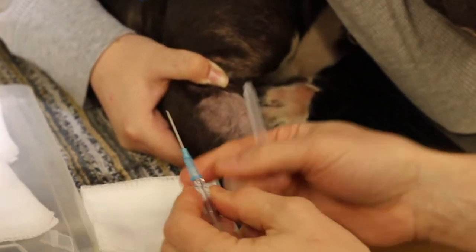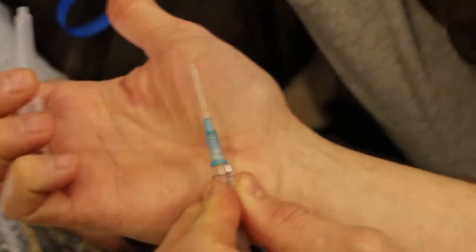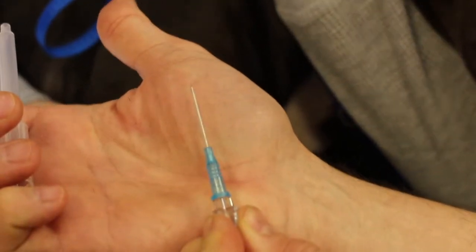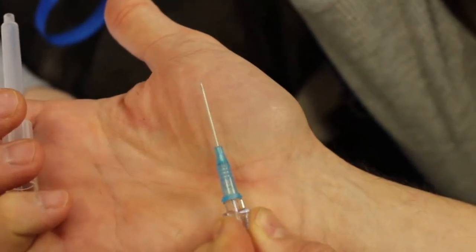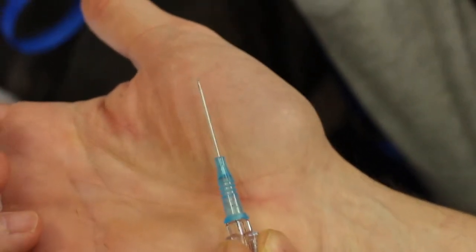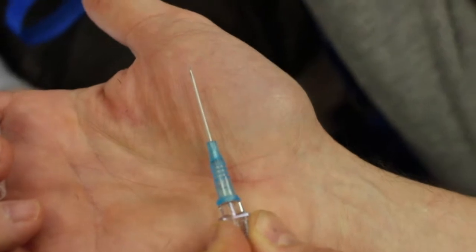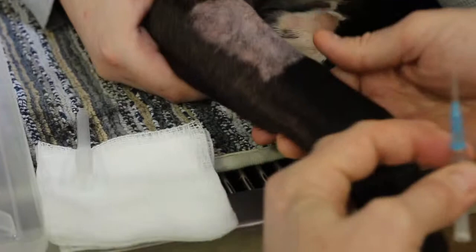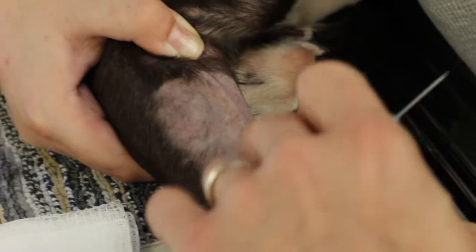You can see there's probably three millimeters of metal stylet exposed before the catheter tip. So I've got to go in the vein at least three millimeters for that catheter to be able to thread. And then when I put this in, I'm going to put the stylet into the vein, and then I'm going to try to see the vein.